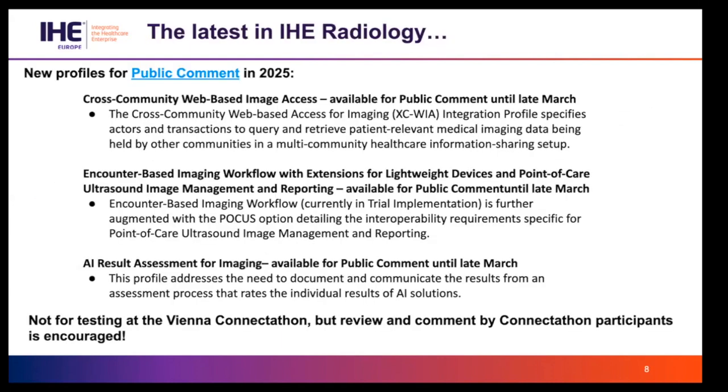So the new profiles which have been developed by IHE in this cycle and are coming to public comment as we speak in 2025. Let me talk about that a little bit. One of them is the cross-community web-based image access profile, which is now available for public comment.